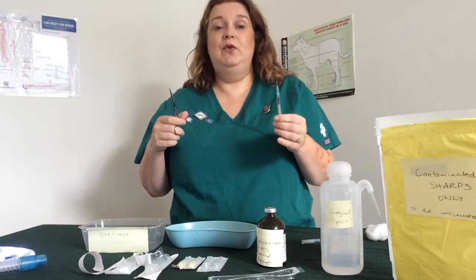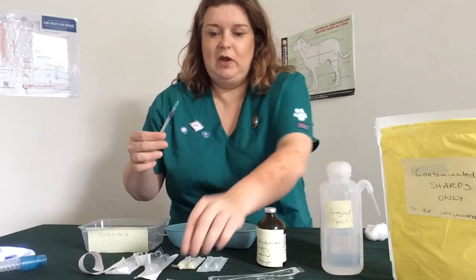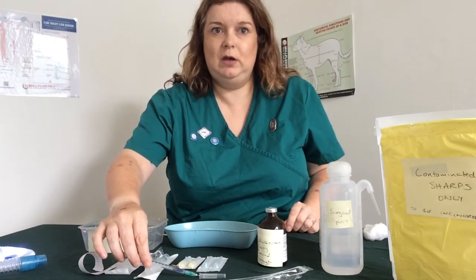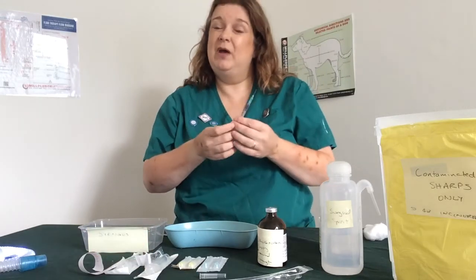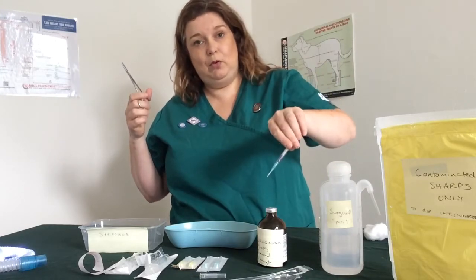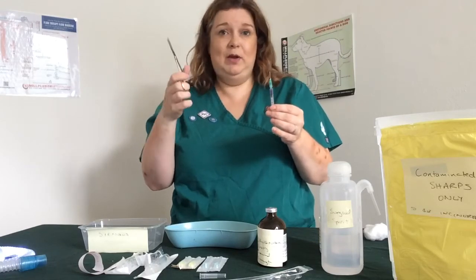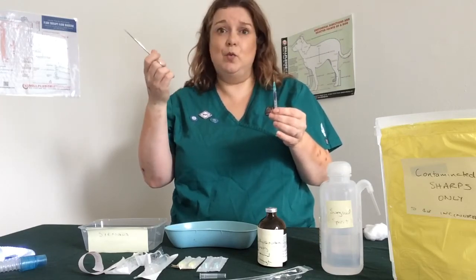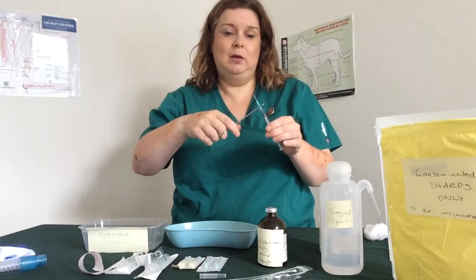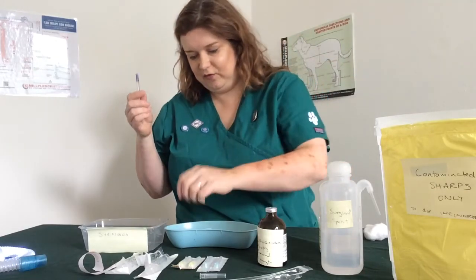Not great. You can potentially scoop this around the table. So I'll get that in shot. So you could do that, but if you're shaking in the exam, do you know what, I would probably poke the table. You can put this back into a foam block and then pull. Other option, forceps. You can get a little pair of forceps, about £3 on eBay, buy them through work, keep them in your pocket, use them at work so that when you're in the exam this is a natural thing. Get rid in sharps.